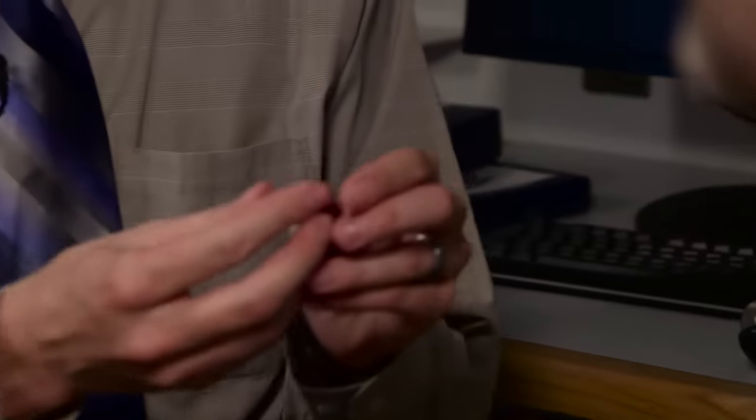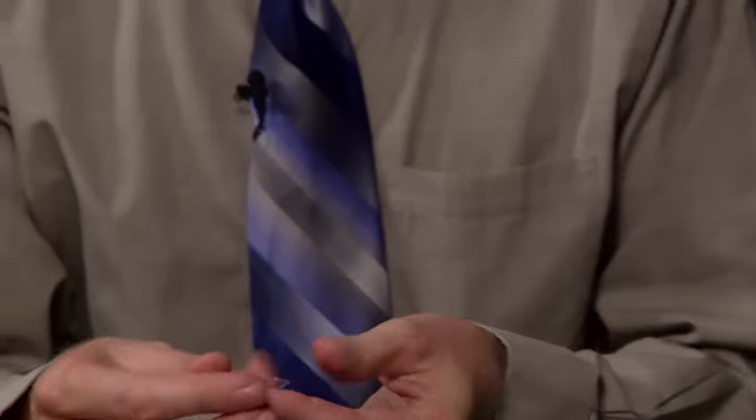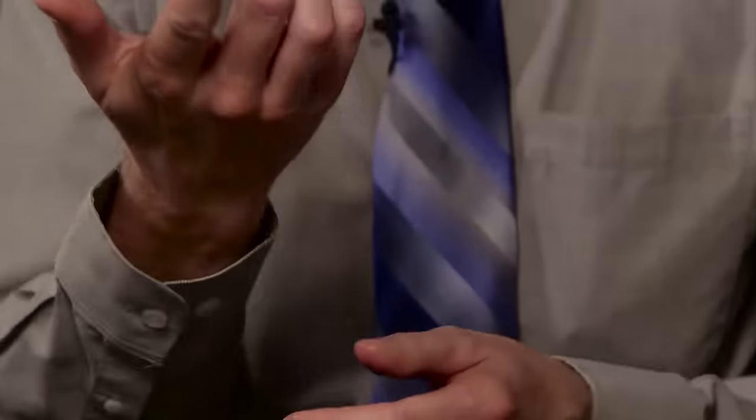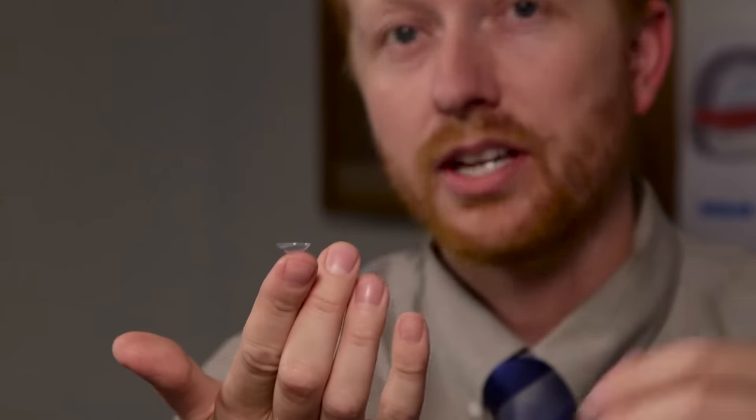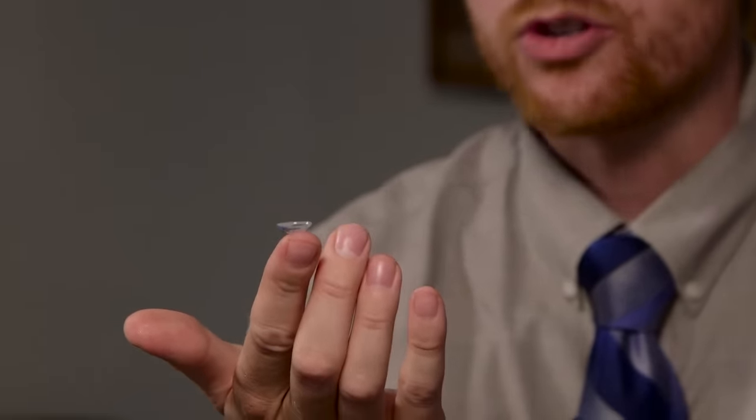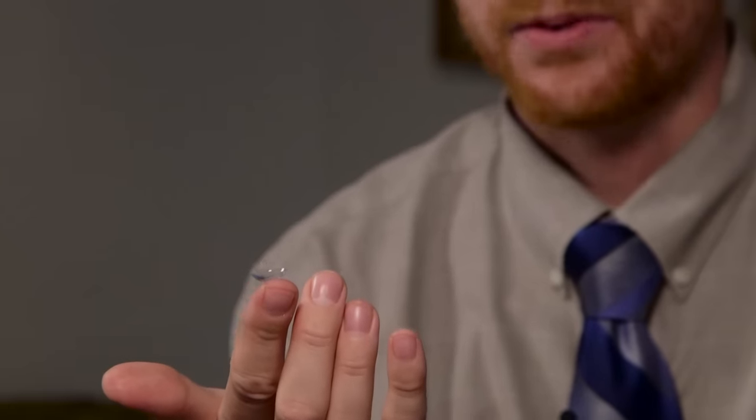So for today's purposes, we're going to be fitting the patient with a Biofinity toric contact lens. And when you take it out of the blister pack, it's important to make sure that the contact lens is not inside out. And the best way to tell is to kind of hold it up against the light. And if you look at the edge of the contact lens, the edges should point straight up toward the ceiling like a bowl. If you look at it and the edges are kind of flared out or splayed out, or they're kind of flattened out, that usually means it's inside out. Now that usually doesn't cause a lot of problems, but it can cause some discomfort for the patient. So make sure that the contact lens is not inside out.